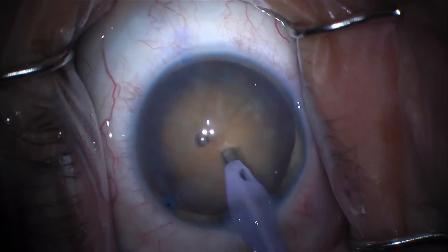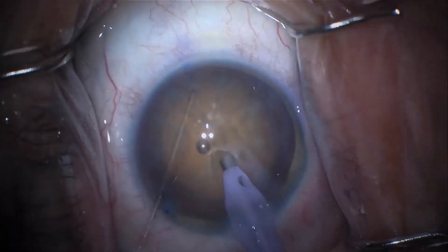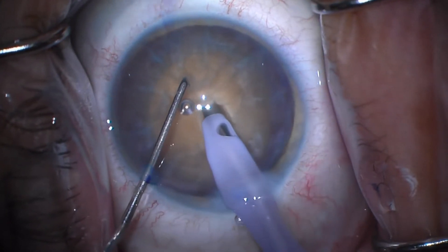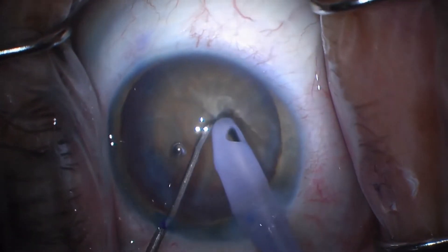I'm going to make a little groove which is sub-incisional here just to get this crack started. I'm going to make a fairly deep groove here. And now I'm going to try several times to crack it. I know I'm not going to be able to do it the first time, so I'm going to make one deep embed and I'm going to make a little score here.